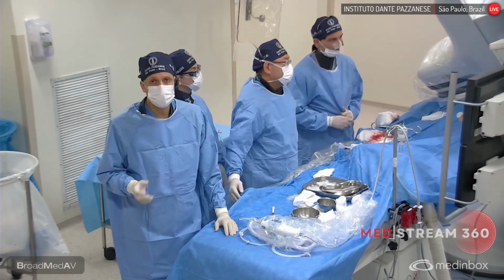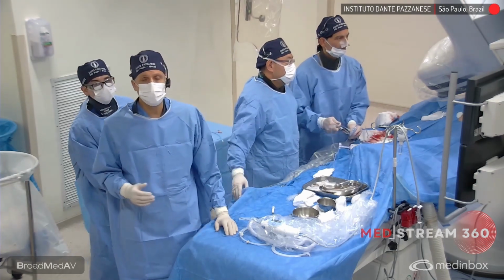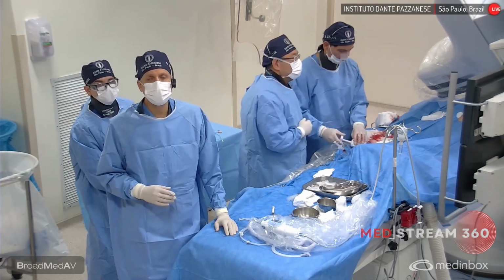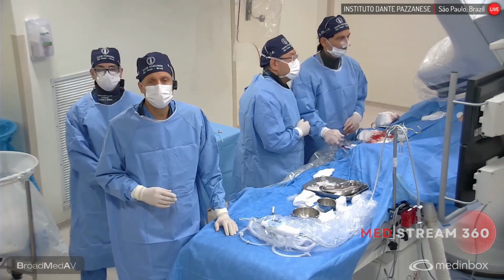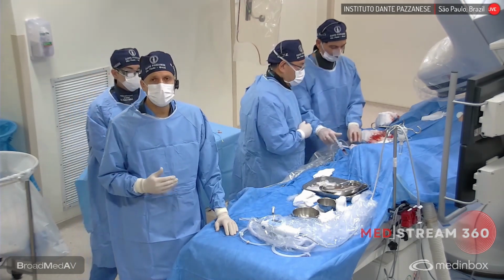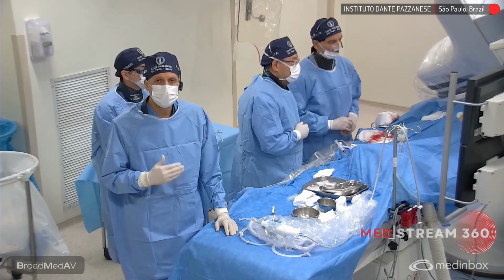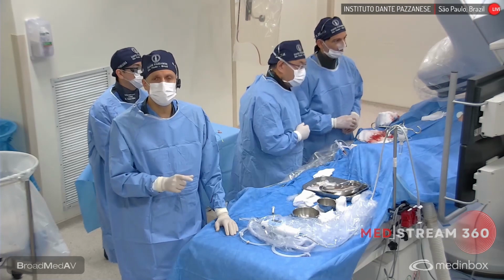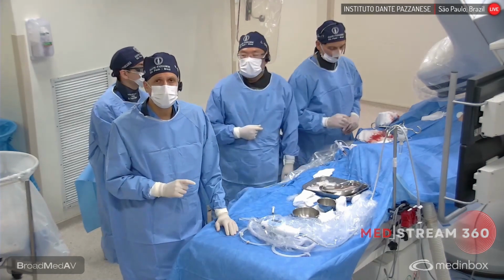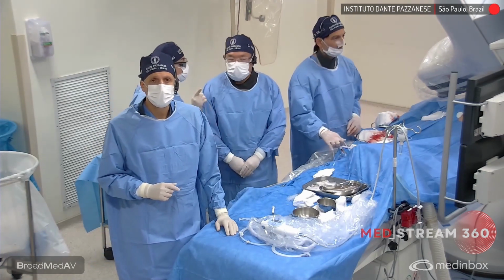You're right. This case was discussed in the heart team environment. He has a 23 SYNTAX score. He was eligible for either revascularization method, and we are demonstrating here with IVUS and angio-based imaging guidance this procedure, which included first stenting the mid LAD, then we stented the left main circumflex with a nano-crush technique.